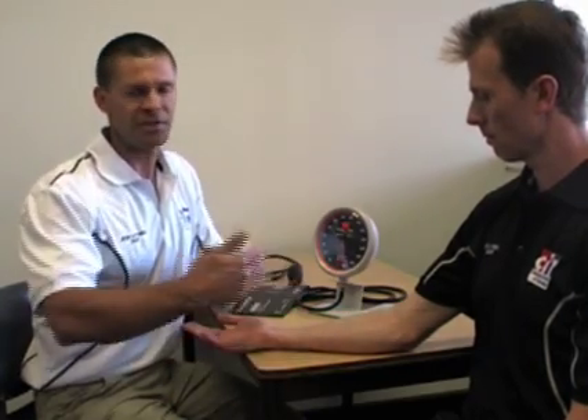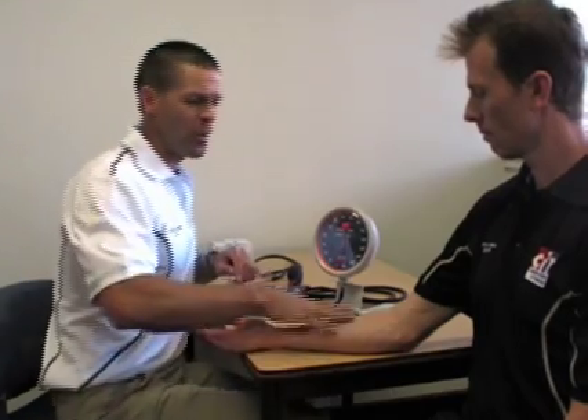We'll assume that Simon, our client, is nice and relaxed. We'll give him some background about why we take blood pressure and its importance, then get everything set up. There is some debate about which side of the body is preferable — left or right — but it really doesn't matter; use whatever is comfortable depending on how the assessment room is set up. Have the client place their palm facing up, with the arm resting relaxed on top of a table, as body positioning is very important.